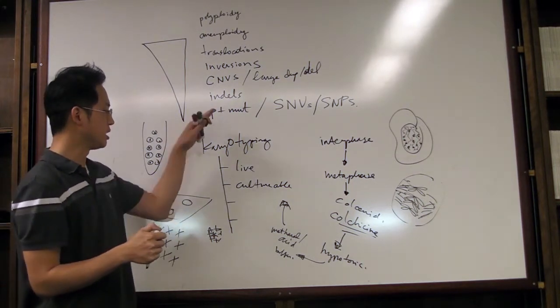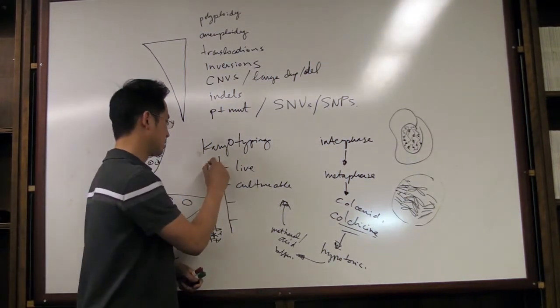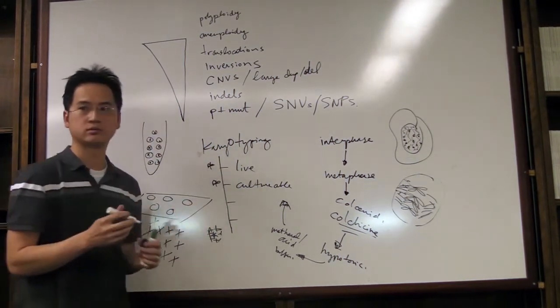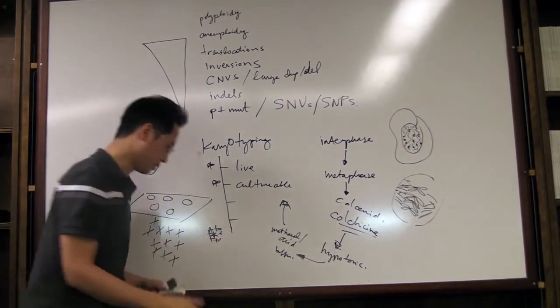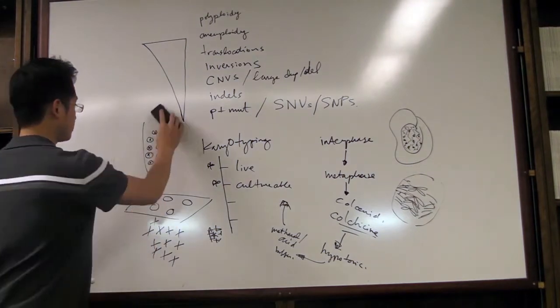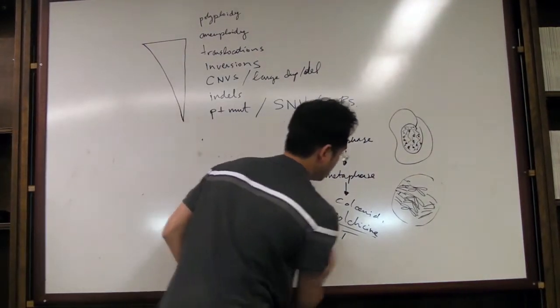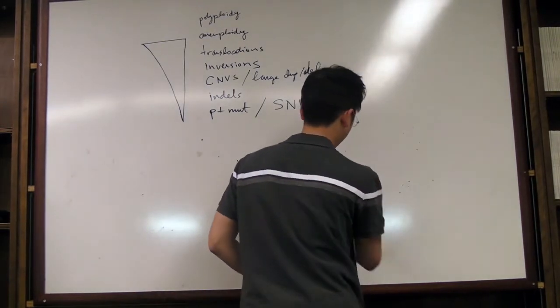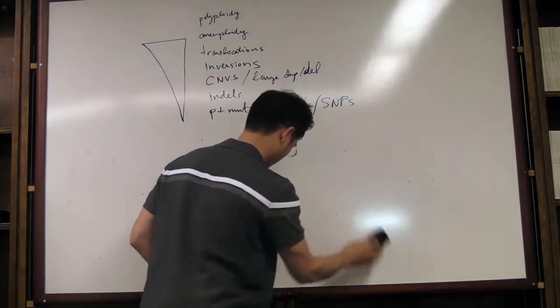And we'll talk about the other things about karyotyping in just a bit, but these are sort of the two key things. Is live tissue and it has to be cultured. Or grown in vitro are the two main things. Okay? So what can you do with a karyotype? I need to probably speed through this because we need to get to FISH after this.